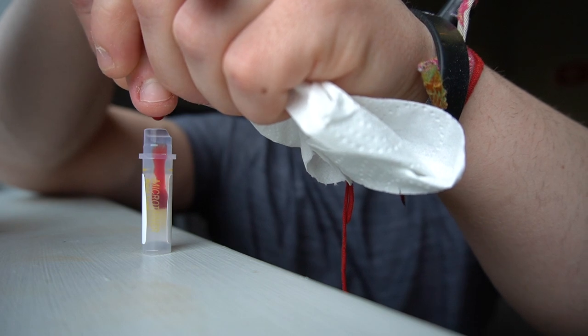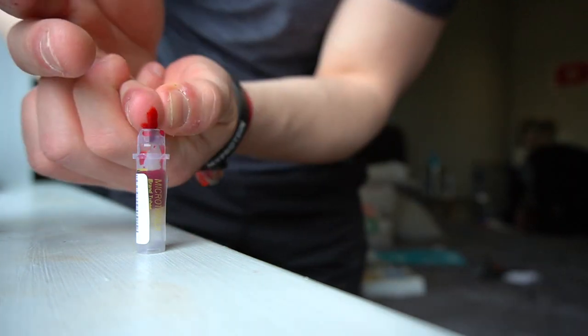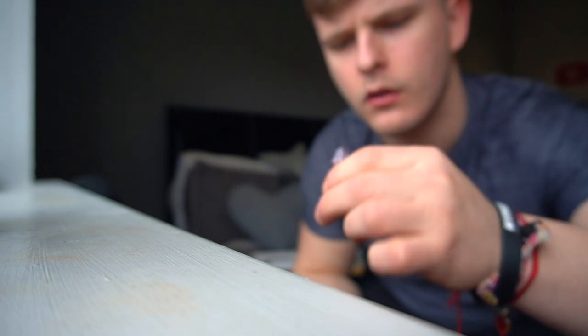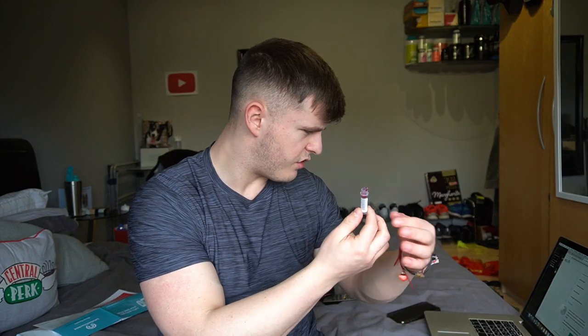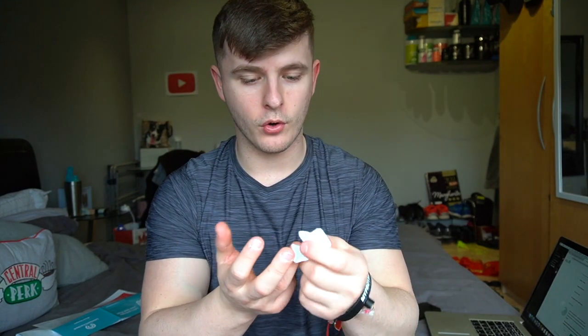Come on. Okay, I think we more than filled that. Let's just get rid of that — it's dropping off the edge of my finger — but I think that's good. You must fill the blood collection tube or your sample will be rejected by the laboratory. That's filled, right? They actually said to me, if you struggle to fill it, just do a few jumping jacks, get the blood pumping, you pierce the skin, and then boom, it'll come out a lot quicker. But I didn't struggle to fill that at all. That was way easier than I expected.